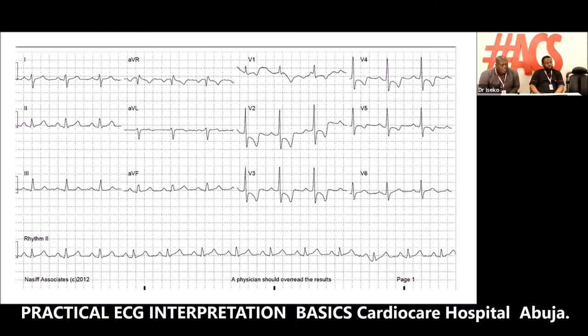Is it a normal reading? The P wave in lead 2, is it upright? In aVR, is it upside down? Yes. Okay. The RR intervals, are they equal? Yes. Look at that reading strip at the bottom. Can you look at the reading at the bottom? You can see that.